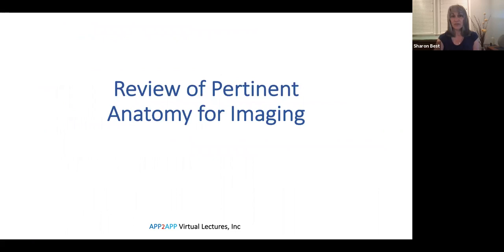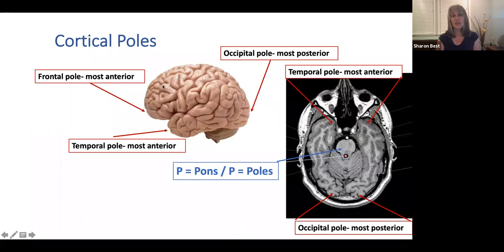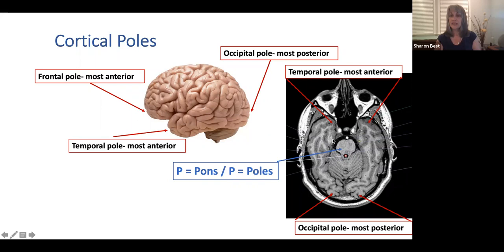We have the frontal pole, the occipital pole — the most posterior aspect of the occipital lobe — and the temporal pole — the most anterior aspect of the temporal lobe. On this axial MRI at the level of the pons, you'll learn to recognize that when the brainstem is shaped this way, you're about midway through the pons. Remember: P for pons and P for poles. At this level you can be looking at the temporal poles on right and left — both look quite full — along with occipital lobe in the posterior aspect and some cerebellum receding away.